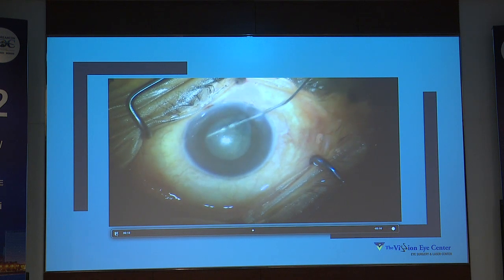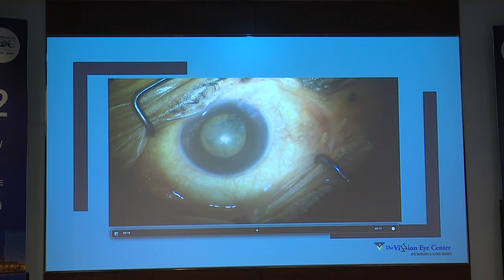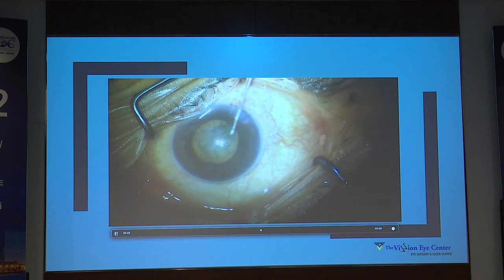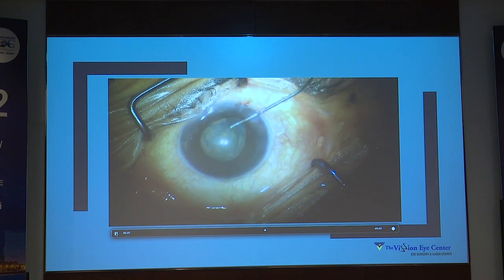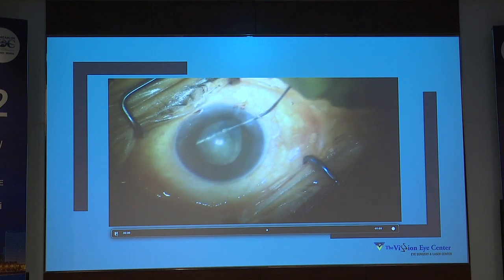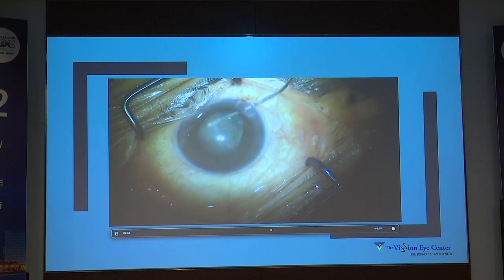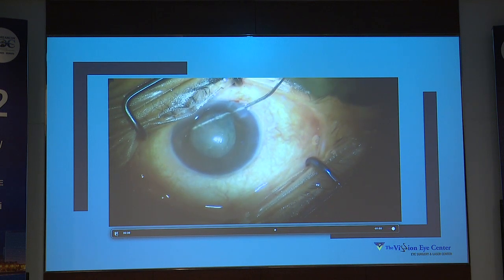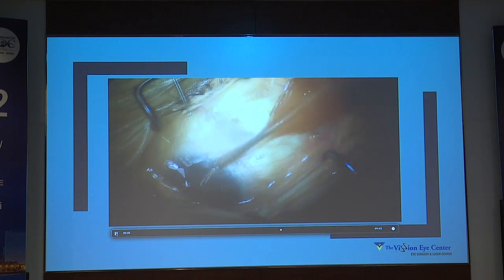Okay, look at the iris trying to come out from my wound. Already anticipating trouble, because I go with the phaco, with the fluid right now, I might create more trouble. Now, as I put fluid, I'm not sure, the whole bag is extremely, extremely tense. It's not moving, there are capsulocortical adhesions here. I can't put in more fluid because I'm worried that I might rupture the posterior capsule. There's not enough place for things to escape. The wound is not very friendly for that.